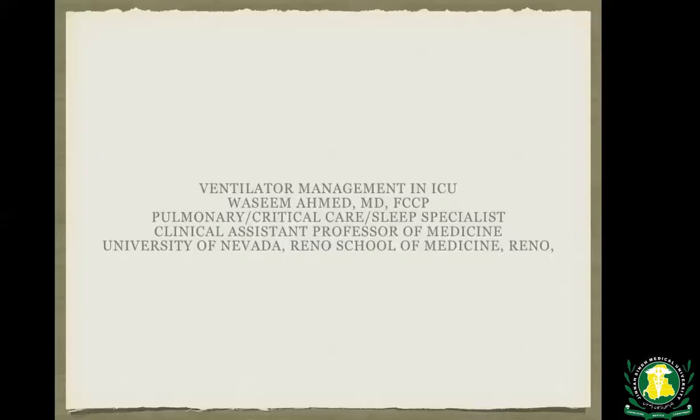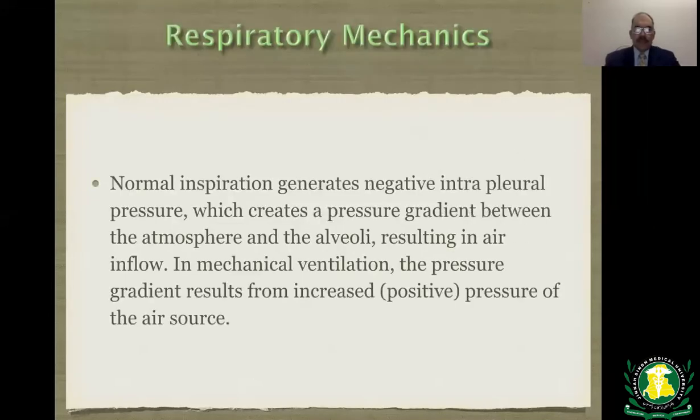Ahmed. I'm a graduate of SMC class 1988, and today I'm going to talk about ventilator management in intensive care unit. Before we talk about ventilator management, I'm going to talk about normal mechanics.